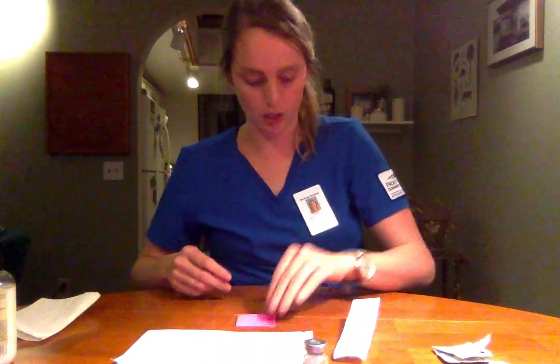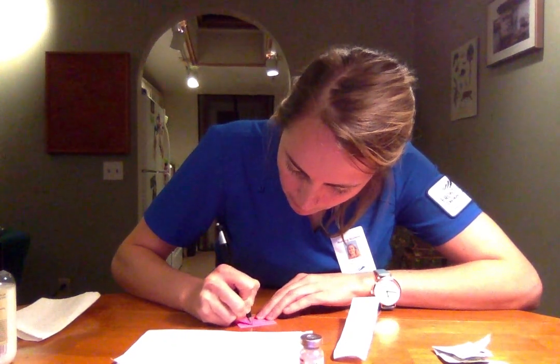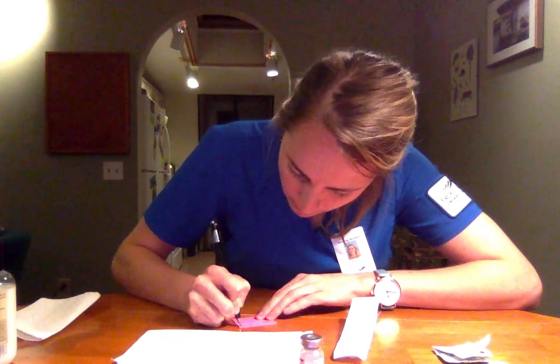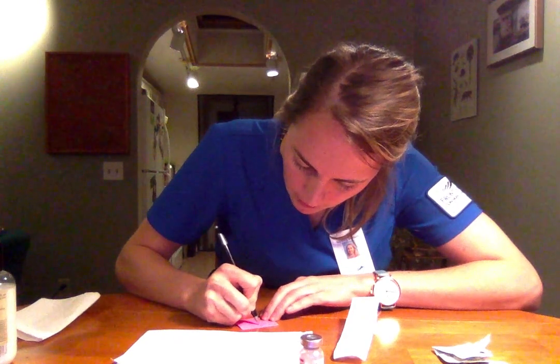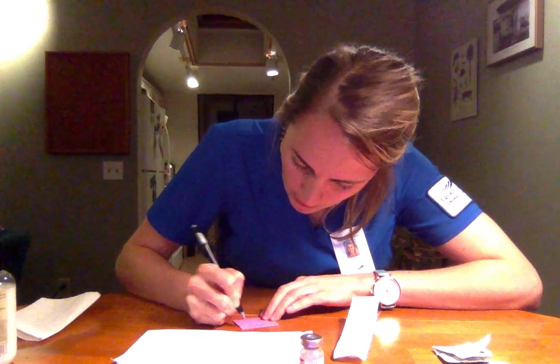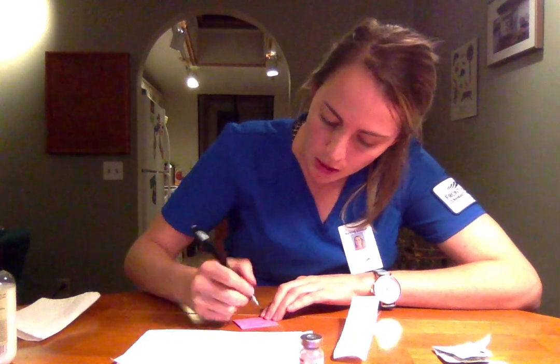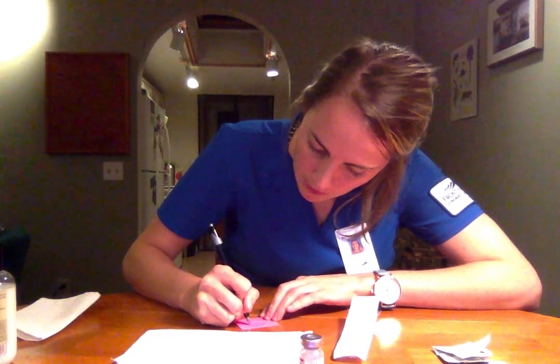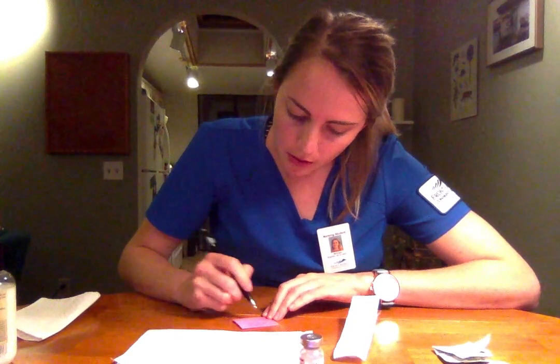Now I'm going to write my medication label. Alright, looking at the MAR as well as the vial here. Okay, patient Abby Abdomen. Drug NPH insulin. Okay, amount 26 units. Okay, and I'm writing out units.